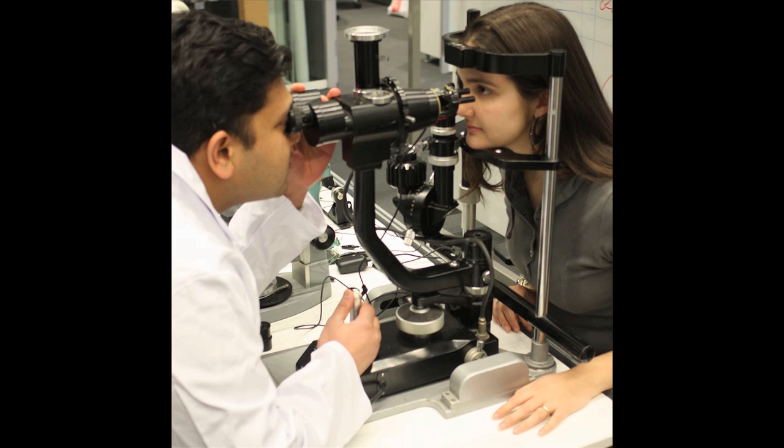Cataracts are the leading cause of blindness worldwide. Existing diagnostic methods require slit lamps.